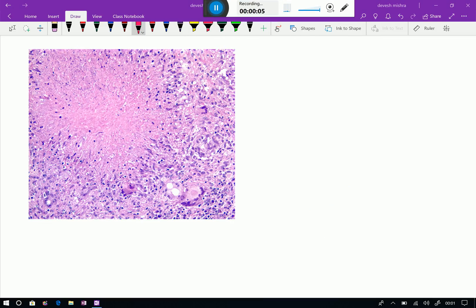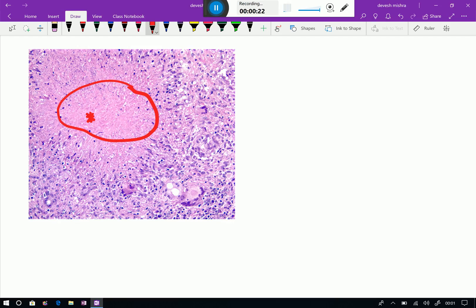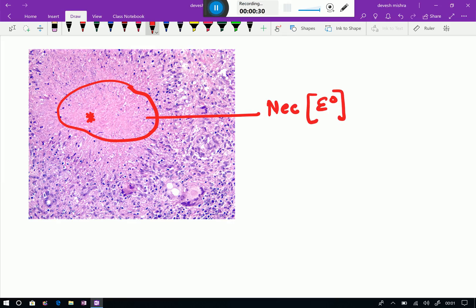Hello friends. Now I was talking about granulomas, so we should know how a granuloma will look like on histopathological examination. We can notice here this area which I am encircling — this area is a necrotic area. How will you identify it? It is completely eosinophilic. This is the necrotic area. When you look at the surrounding areas, you can see small round mononuclear cells scattered throughout the biopsy.